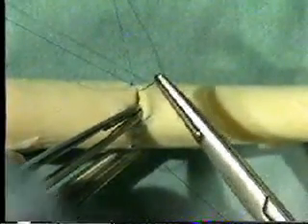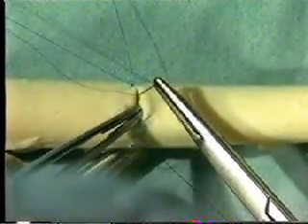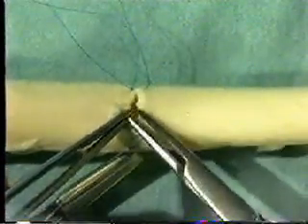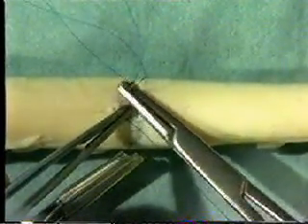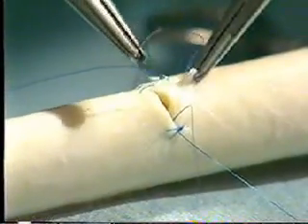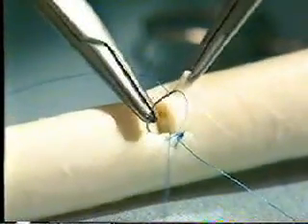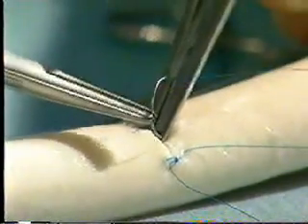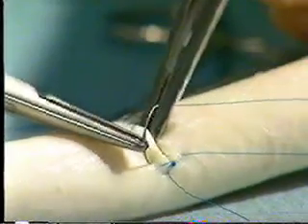Once again go from outside to inside on the upstream part of the vessel, and inside to outside on the downstream part of the vessel. Continue in the same manner up towards the apex, being careful not to traumatize the vessel wall with your forceps, and rolling the needle through the tissues rather than dragging it through.